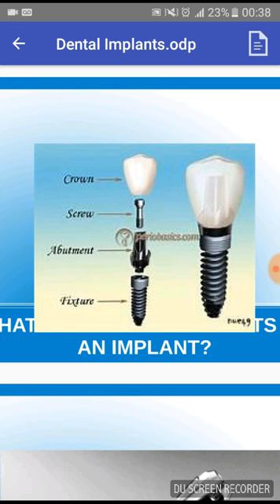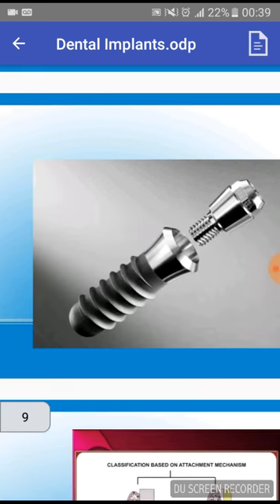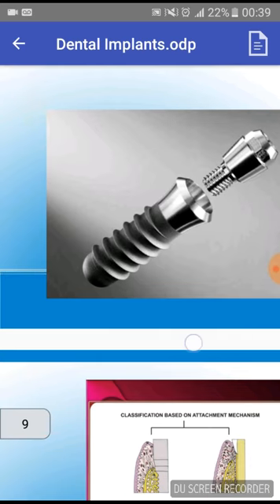You can also use titanium alloys, and they have similar properties. However, they have higher strength, and the modulus of elasticity is actually higher than pure titanium as well, and they still form the oxide layer as before. So it encourages osseointegration. This is an example of a titanium screw.